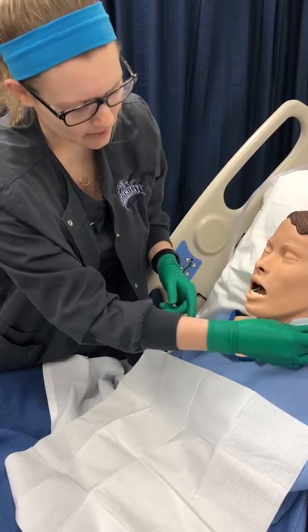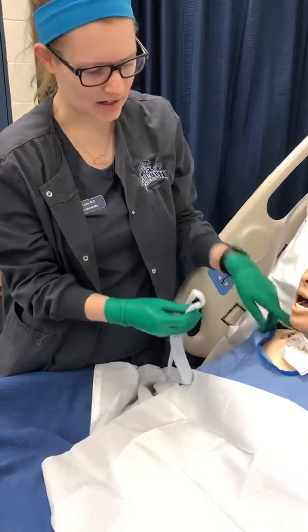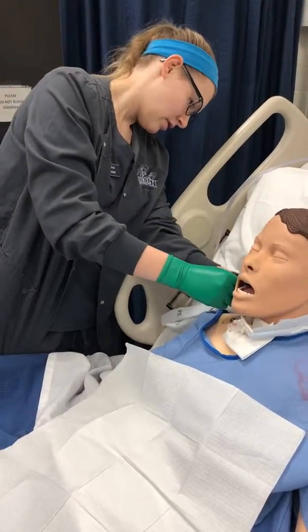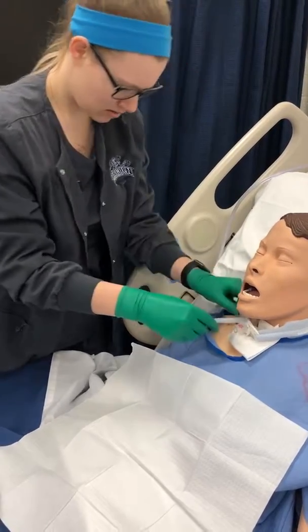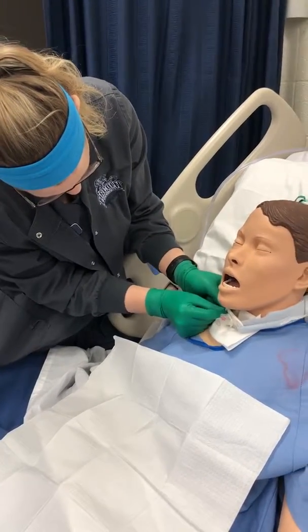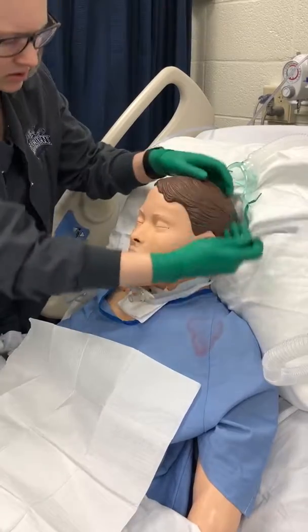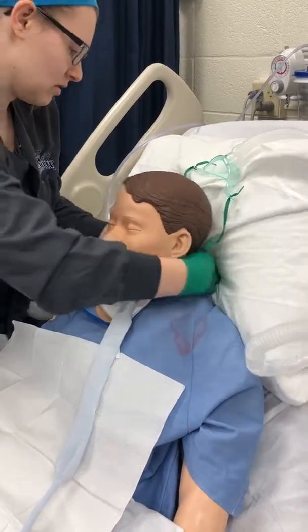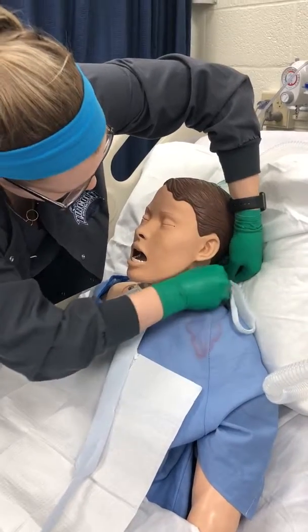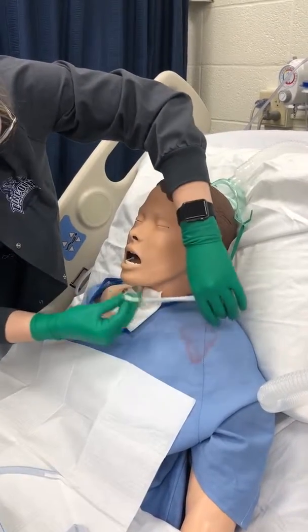And then this trach tie, if it is soiled, you can grab another one and just change it out. Just do one side at a time so that the trach stays secure and in place. And then the old one, wrap the new one around. The old side off, the new side on.